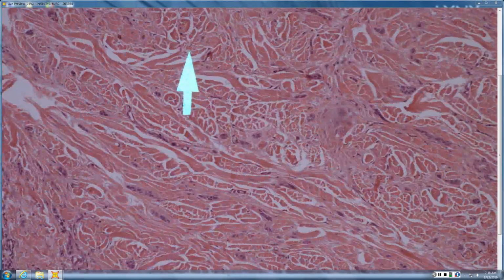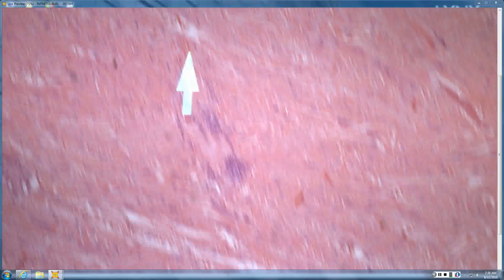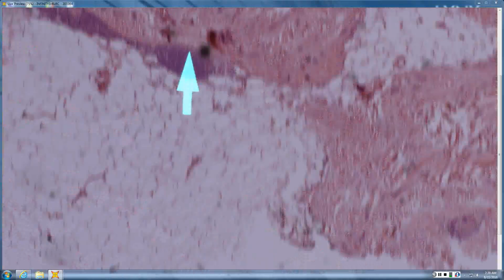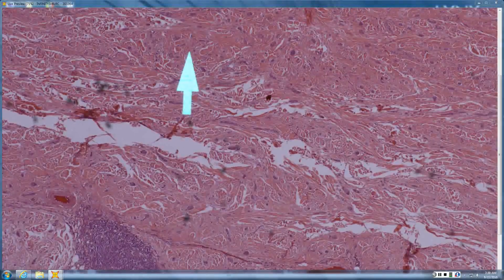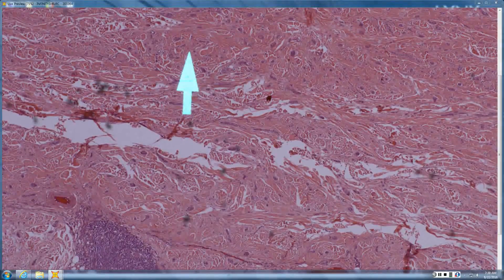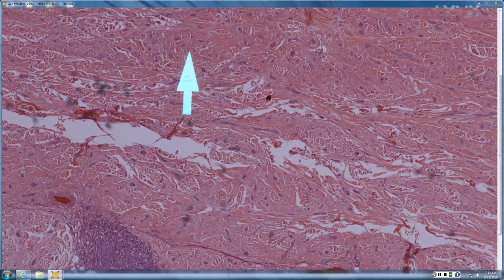So this is something that looks kind of like the syringoma from hell. I want to call this maybe a microcystic adnexal carcinoma. Yeah, a MAC. And what's this variant of MAC called? It looks like a syringoma that just keeps on going with perineural invasion. I'm not sure. So that's the sclerosing sweat duct carcinoma, which is, MAC is called microcystic adnexal because it differentiates pilar and sweat. It goes both ways. And this one doesn't have the pilar. This one is kind of a monophasic MAC.